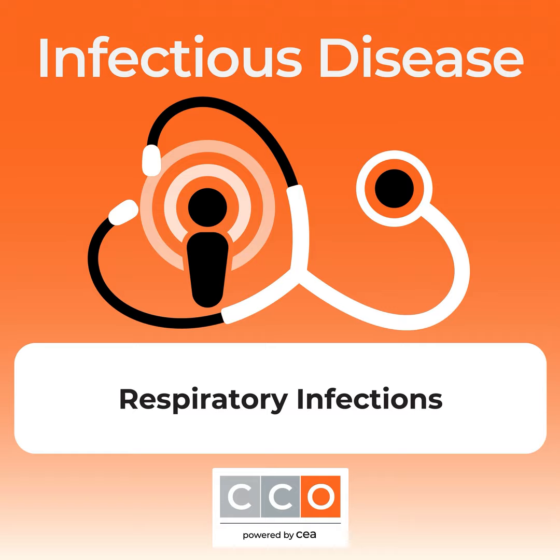This is another study that was done using the FilmArray pneumonia panel for patients presenting with community-acquired pneumonia to the emergency department. It was a single center study. It was randomized. It had 374 patients, and their primary outcome here was pathogen-directed treatment based on the microbiologic result. And when you use this intervention with the pneumonia panel, you more frequently got patients on a true treatment of a pathogen that was detected. However, that didn't necessarily mean that these patients actually had improved clinical outcomes.